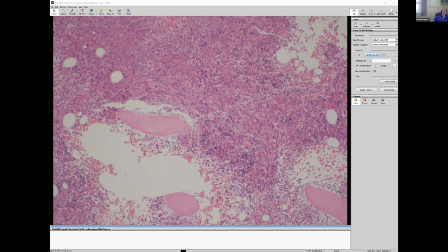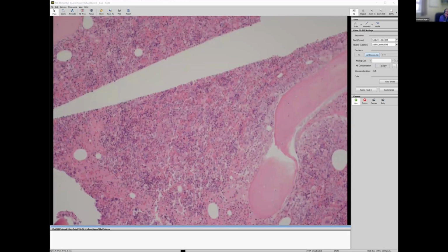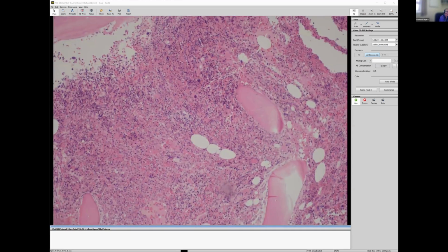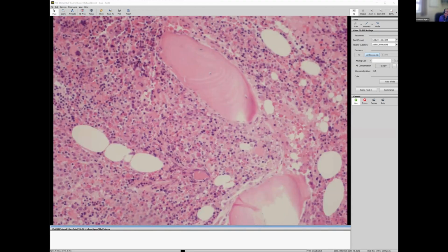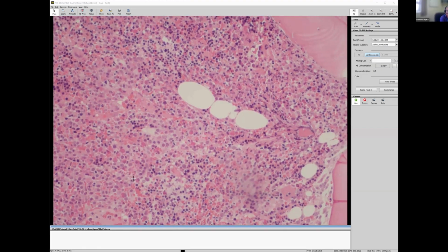So it was a good quality trephine. I think for the age, 84, excuse me, almost maximally hypercellular. You can see even at this power, I got some atypical megakaryocytes like here and here. And there's an awful lot of increased myelopoiesis in the background. There's also a lot of eosinophilia. This was also one with lots of eosinophils. I'll just show you the Diagnexia for that.